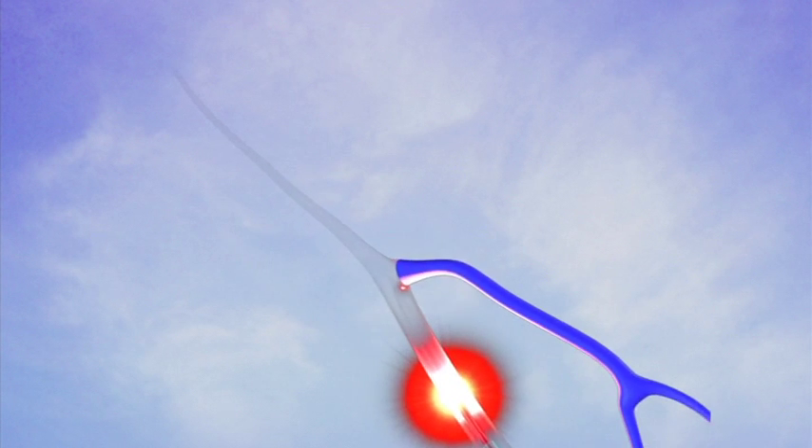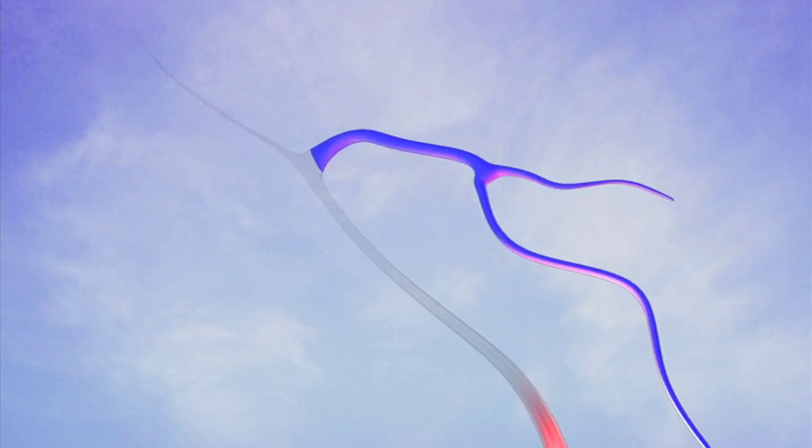With your leg now numb and the catheter in place, the laser or radio frequency device is then turned on and the catheter is slowly pulled back through the vein. The heat from the ablation device thermally injures the lining of the diseased vein and the vein closes permanently.